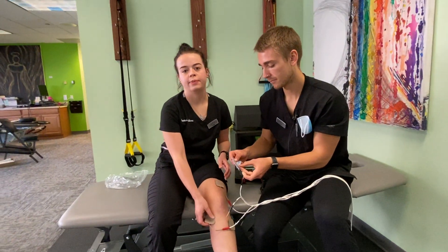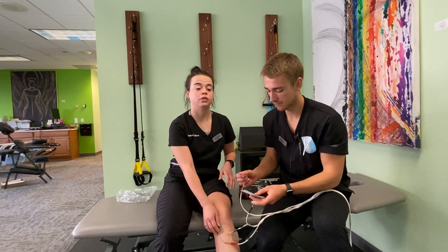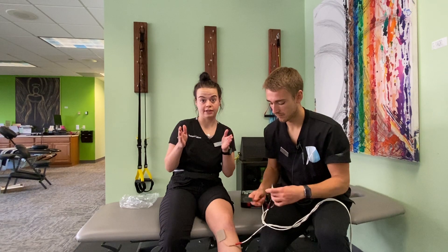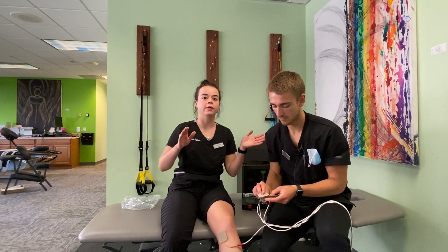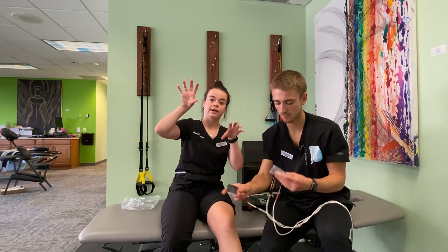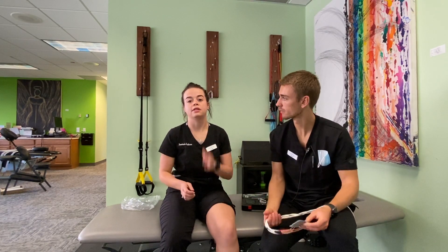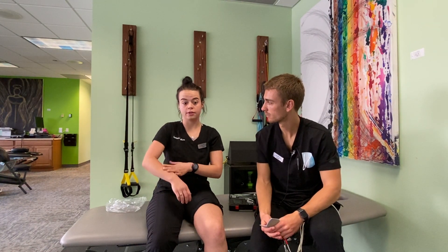You can also place the e-STIM pads on your low back. When you're doing your low back, you want to stay away from the spine but hit the muscles on either side of the spine — with a red and red diagonal from each other and a black and black diagonal from each other. Another common place is on the back of your neck. You could also do shoulders, forearms, or feet — really anywhere you're experiencing pain.